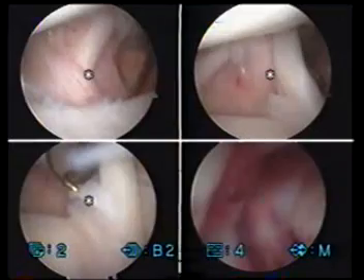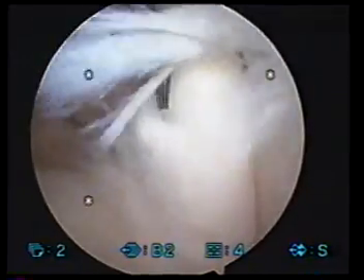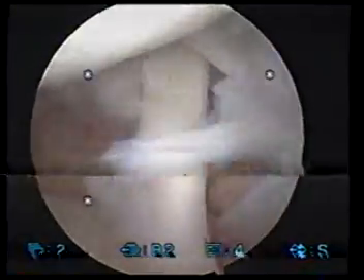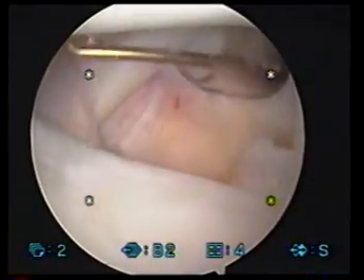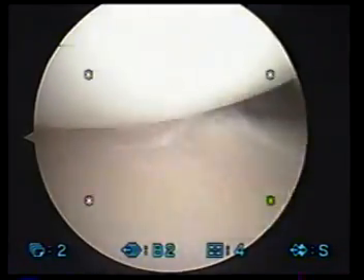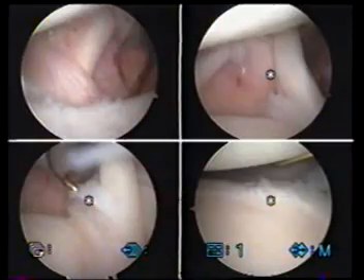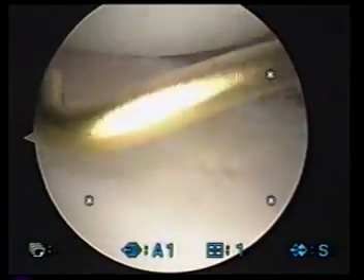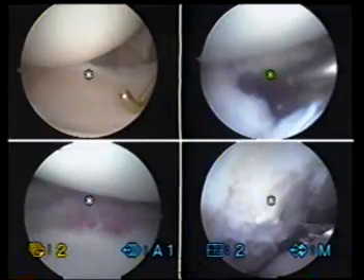First thing we see when we get inside the shoulder is just a minor amount of labral damage here, a little bit of fraying here at the base of the biceps tendon. The biceps tendon itself, as we pull it down into the joint, looks normal. This is your subscapularis — that looks normal. This is the middle glenohumeral ligament, that looks normal. The inferior glenohumeral ligament also looks normal. The ball and socket joint here shows a little bit of wear, as I told you in the office.